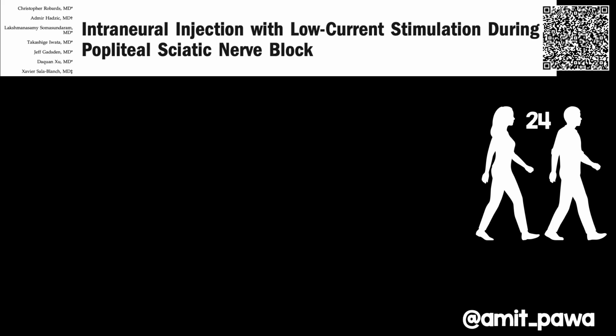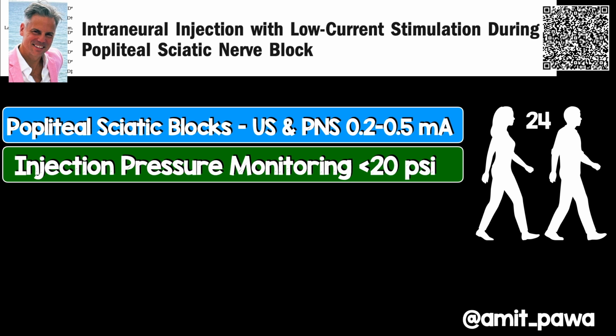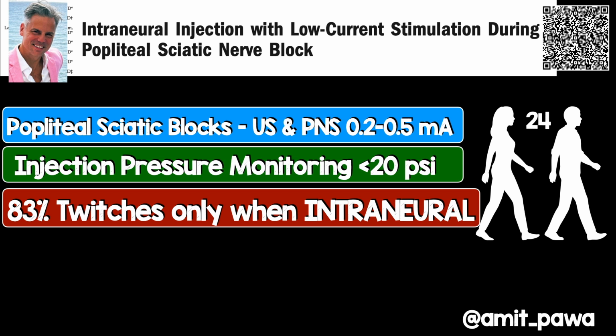Well, what about the love affair between peripheral nerve stimulation and ultrasound? How about using them both together? So this is a great study performed by somebody that you might recognize. What did they do in this study? Well, they performed popliteal sciatic nerve blocks on humans using ultrasound and peripheral nerve stimulation, and they had their twitches set between 0.2 to 0.5 milliamps, and they carried on advancing towards the nerve until they got twitches at that threshold, and if they didn't get twitches at that threshold, they then proceeded to enter the nerve. They used injection pressure monitoring, aiming to keep their pressure below 20 pounds per square inch. And what they determined was, in 83% of cases, they only got twitches when the needle was visualized to be intraneural.